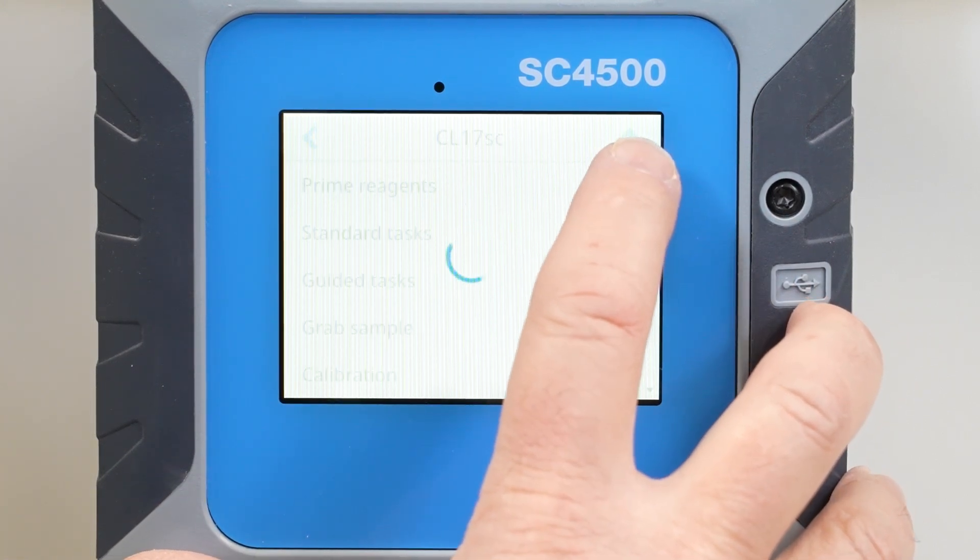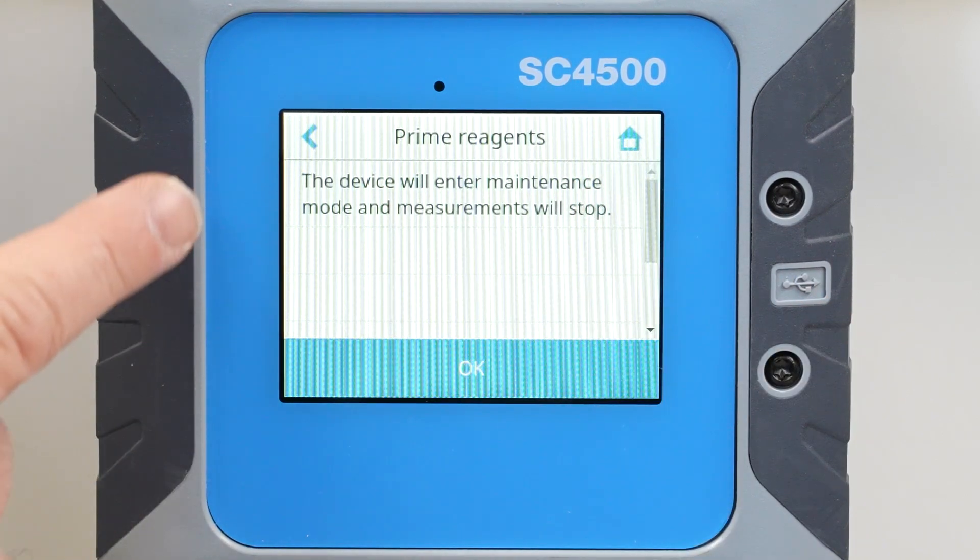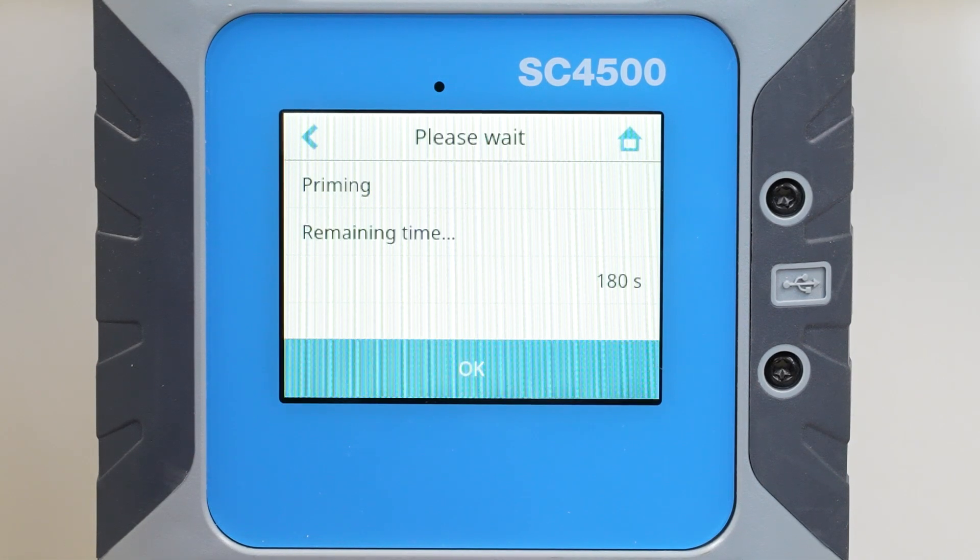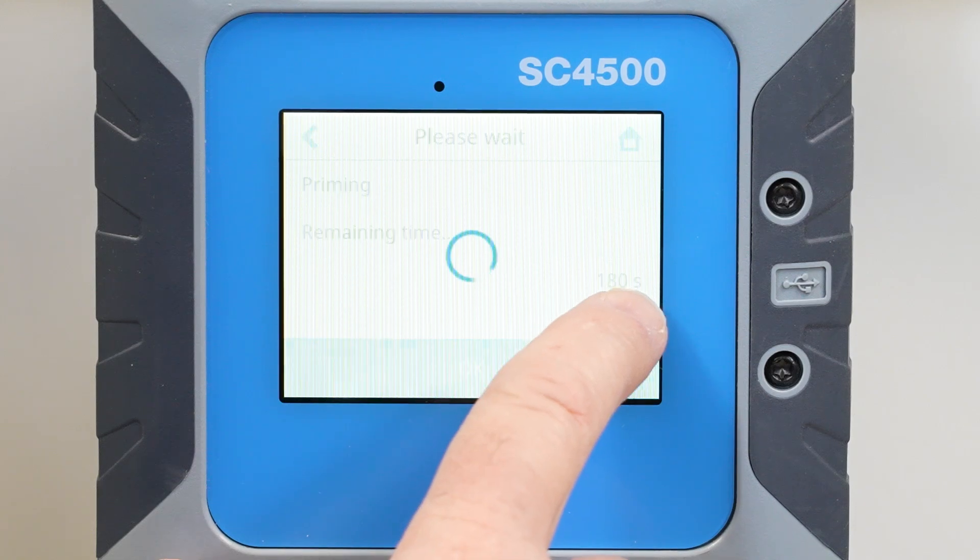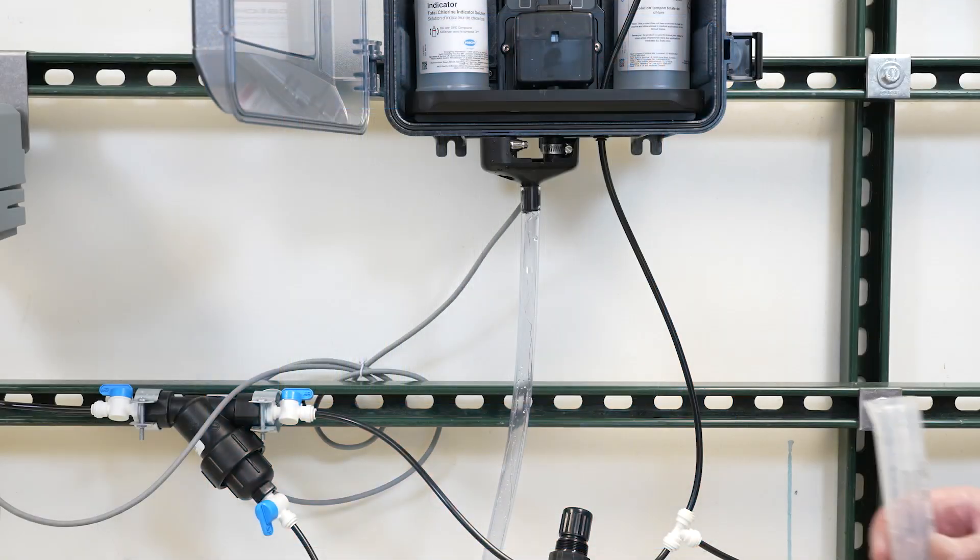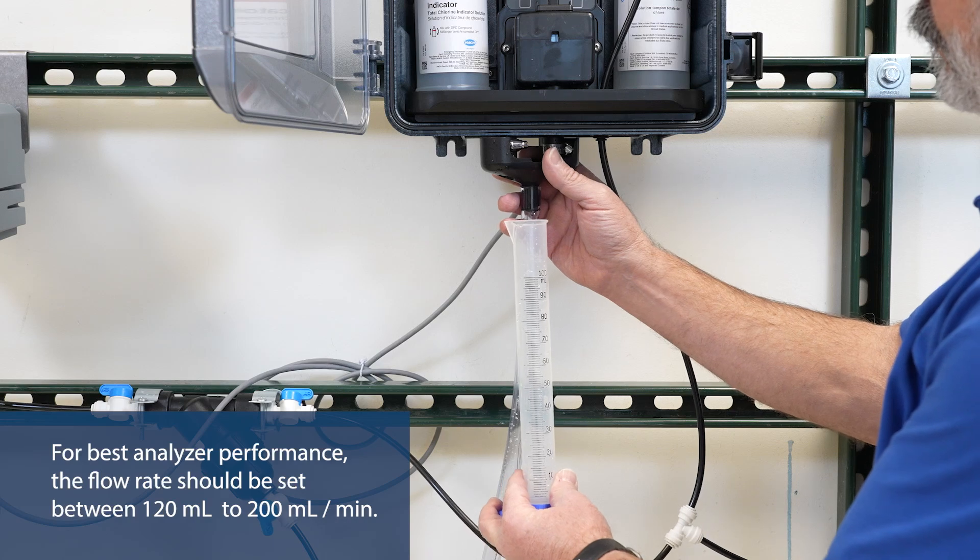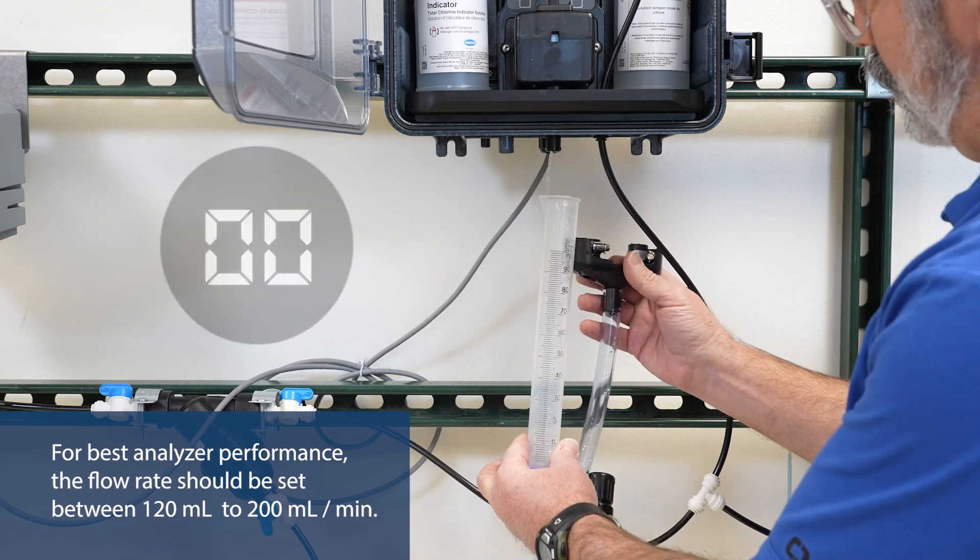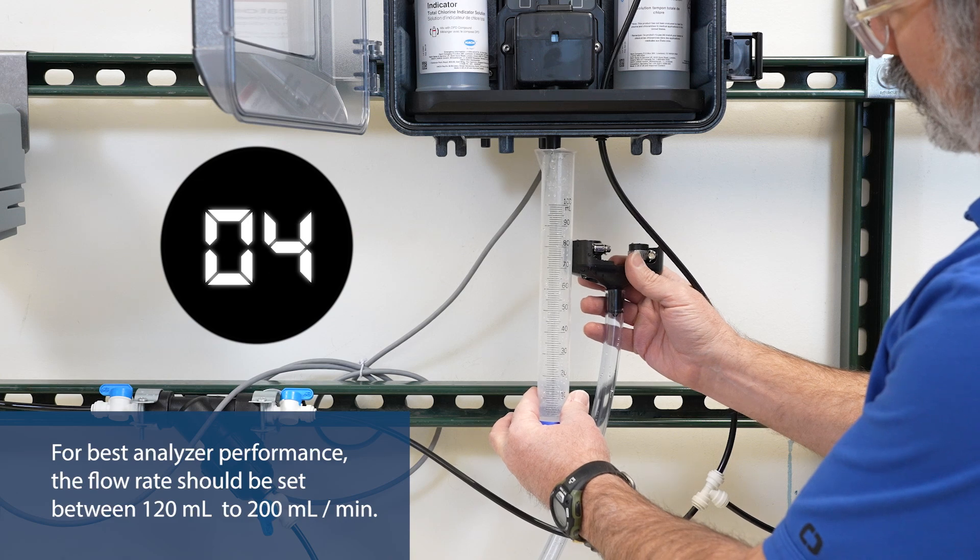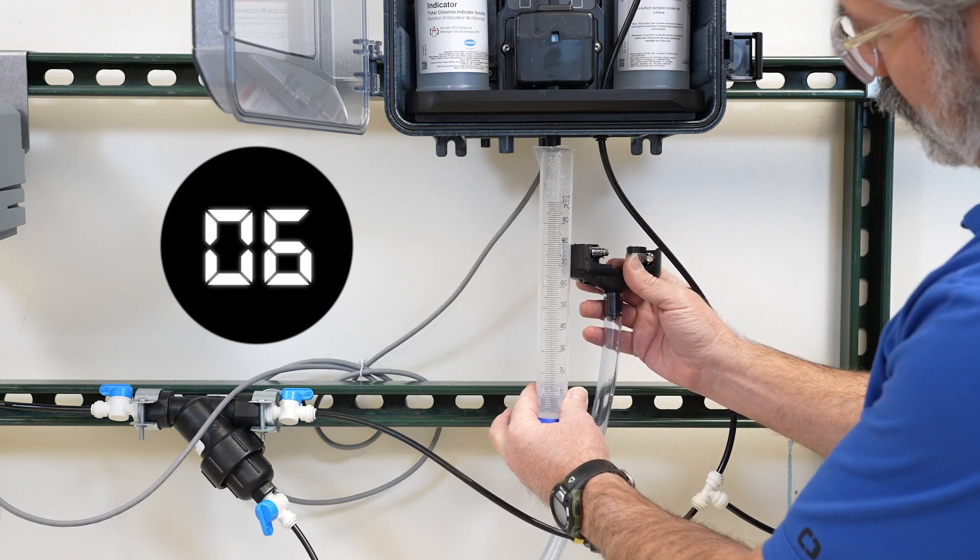Setup and prime the reagents. For best analyzer performance, the flow rate should be set between 120 milliliters to 200 milliliters per minute. Measure the flow at the drain.